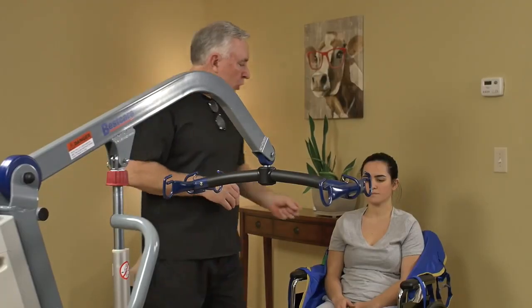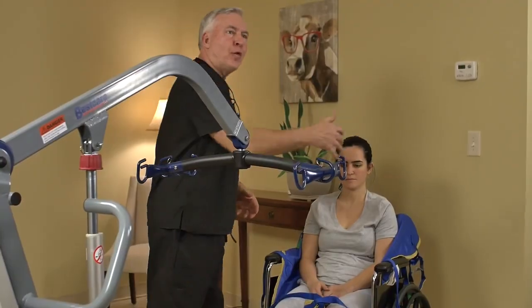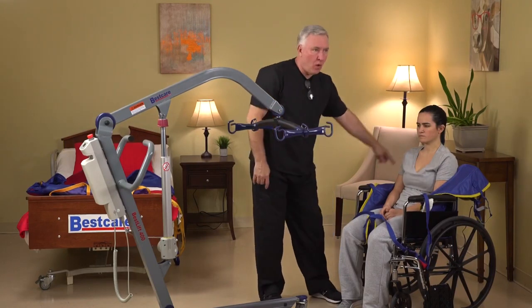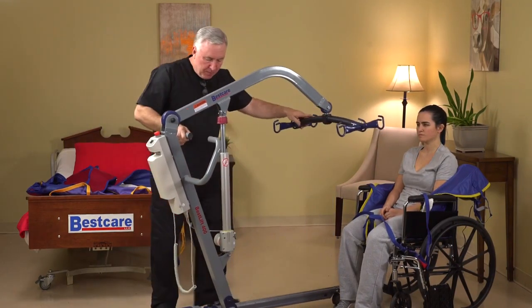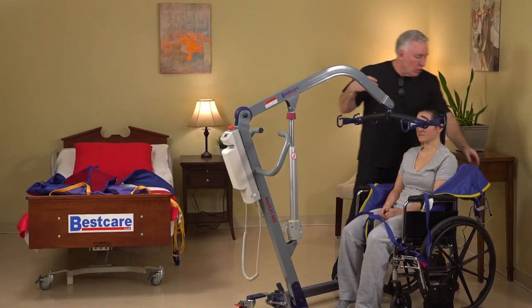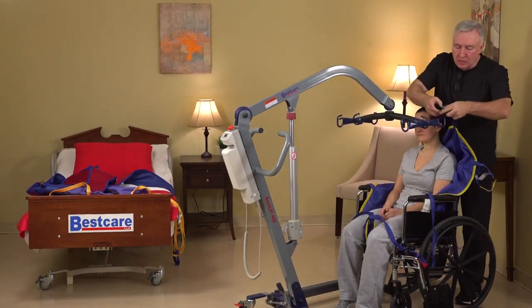The first sling I want to show you is our universal sling with head support. So this sling has 4 loops and hooks on each side of the sling. So 4 straps and loops on one side, 4 on the other. So I'm going to approach the patient with the new 6-point spreader bar, open up my base so I can get around the wheelchair.